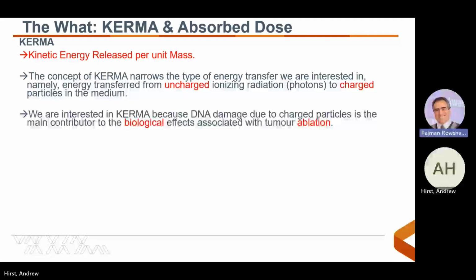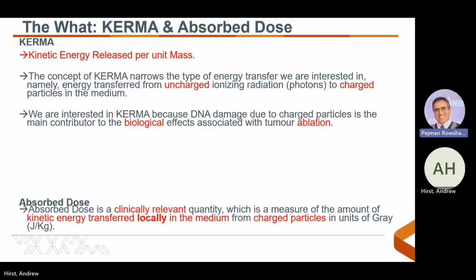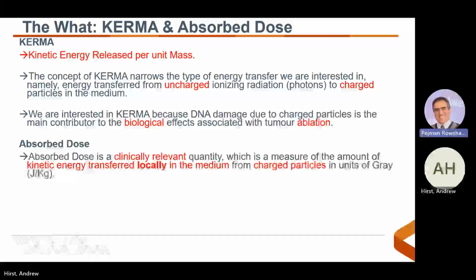And we're interested in KERMA because DNA damage due to charged particles is the main contributor to the biological effects associated with tumor ablation, and that's what we want. We want to basically destroy the tumor with high accuracy and precision. A more relevant quantity, though, which is derived from KERMA, is the absorbed dose.